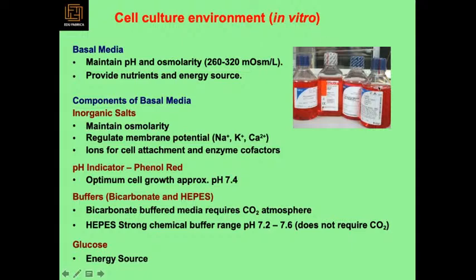These are the bottles that you get from the market. They are a bit expensive because they are ready-made media for you, shown in the red color. These are the basal media, which maintain pH and osmolarity, and provide nutrients and energy source to your cells. So what are the components of a basal medium? It basically includes inorganic salts, which maintain the osmolarity, maintain your membrane potential, and also cell attachment and enzyme cofactors. So everything is there.